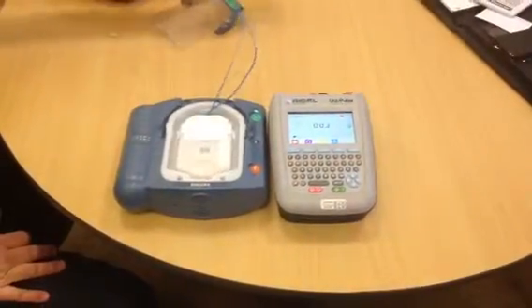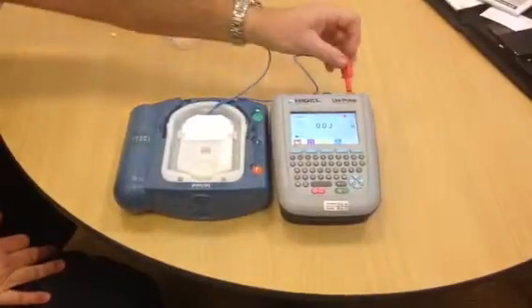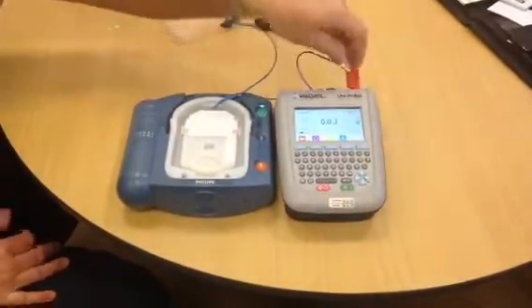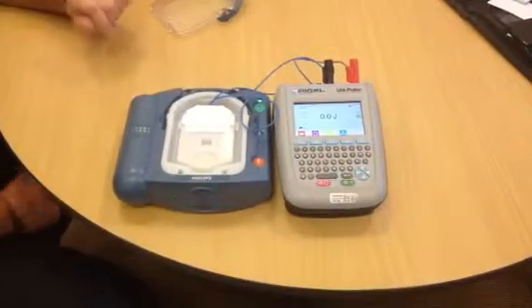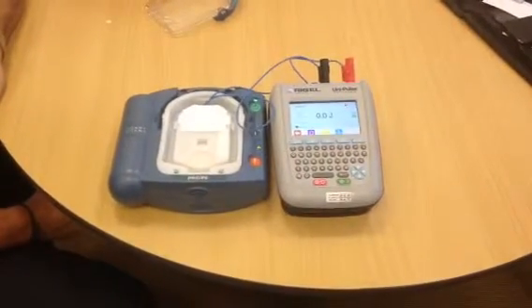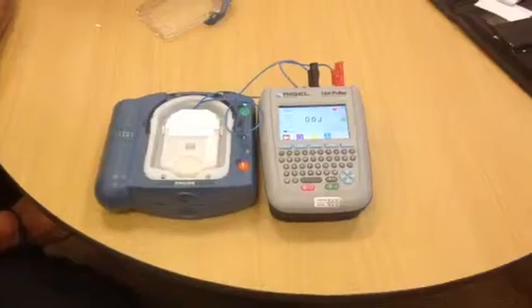Begin by removing all clothing from the area. Place the pad exactly as shown in the picture. Press firmly to the patient's skin. No one should touch the patient — analyzing.